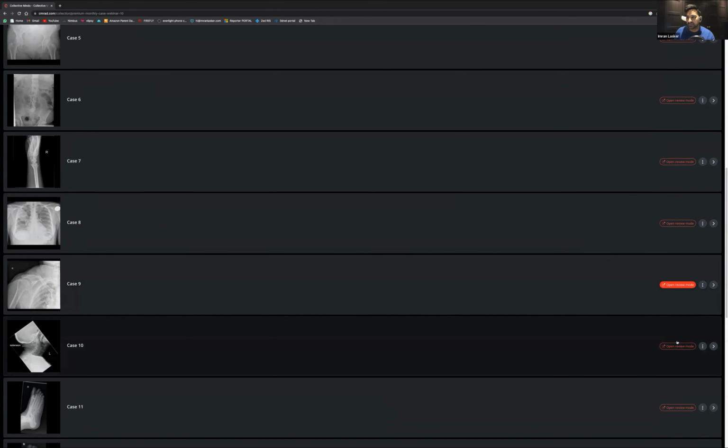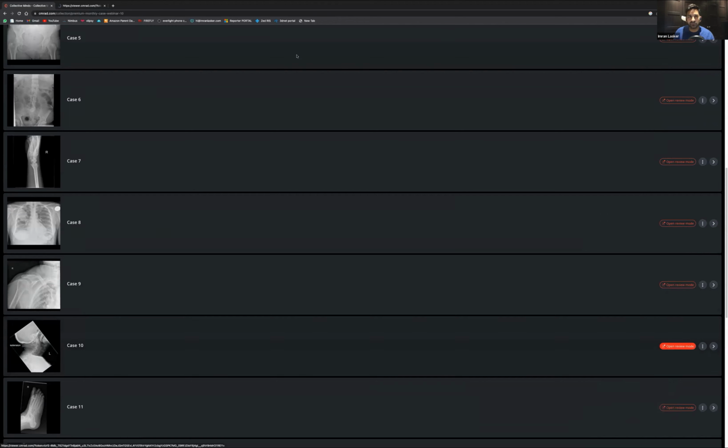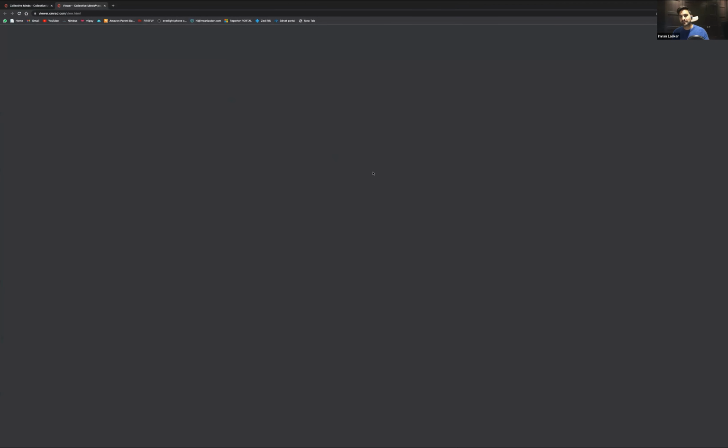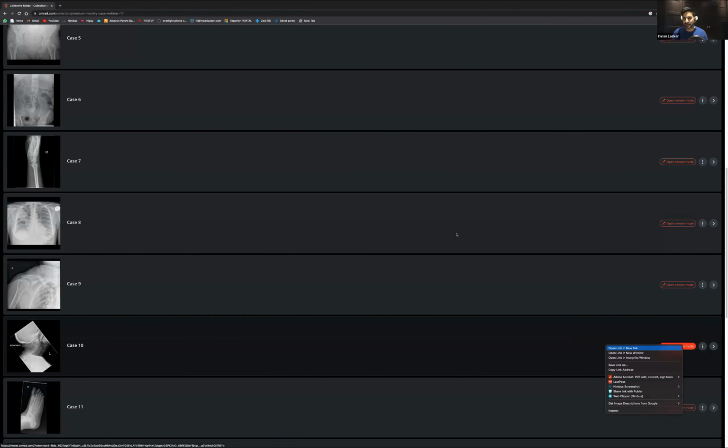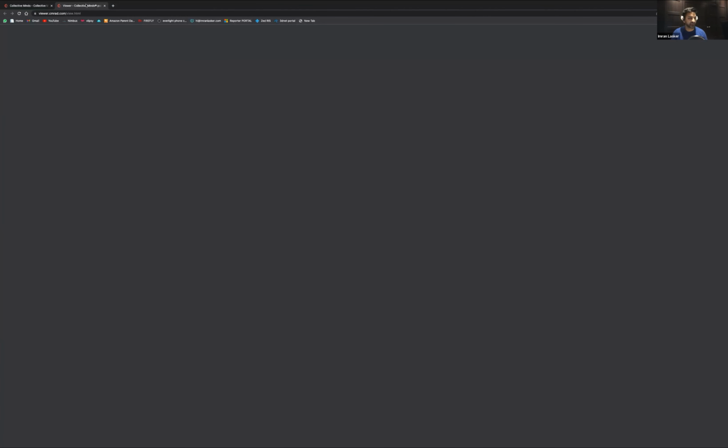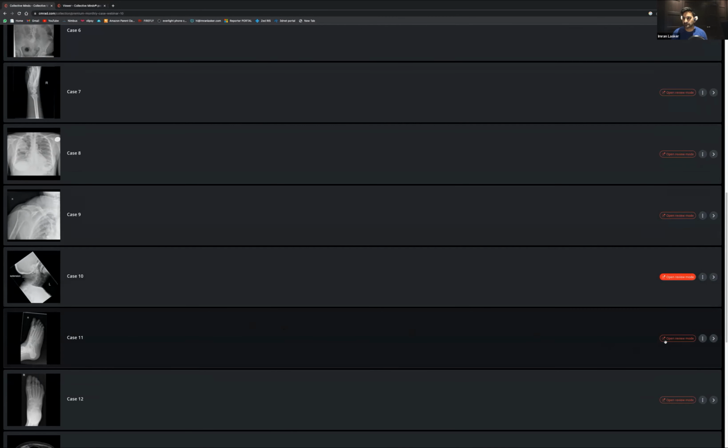Right, let's have a look at this one. Now, C-spines can be really, really worrying. Generally speaking, these days, when someone comes in with significant trauma, you just end up getting a CT, don't you? But I think maybe C-spines may be a bit of a dying art, because if someone is worried, you just get a CT scan. For some reason, that's not loading up just yet. Don't worry, we'll just go to the next case for now.